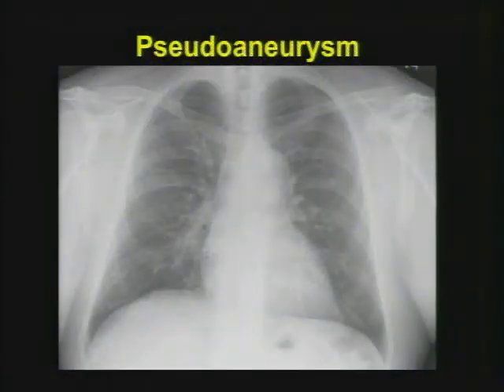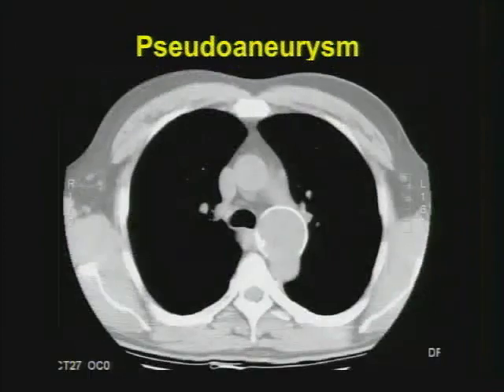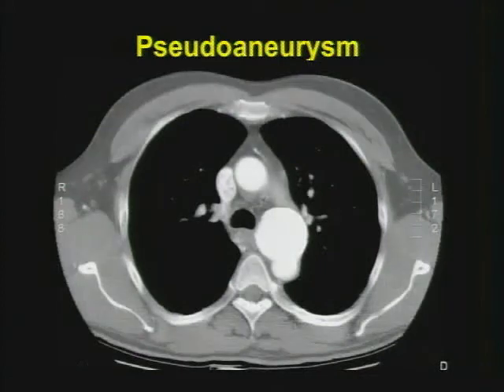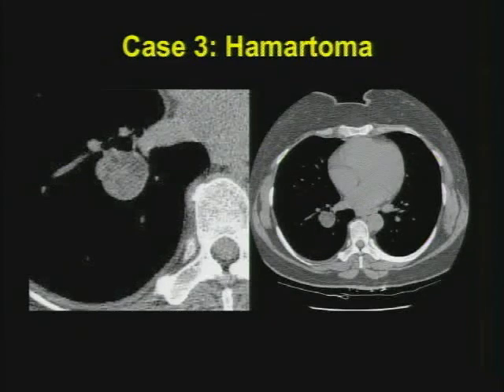Here's a patient: notice that in the AP window there's an extra curved calcific density just below the knob of the aortic arch — a calcified pseudoaneurysm. On CT you can see a nice peripherally calcified lesion with central enhancement after contrast. These are most often now treated by covered stents outside of the inflammatory mycotic setting, so in trauma, covered stents are a great way to treat these without the morbidity of open surgical procedure.